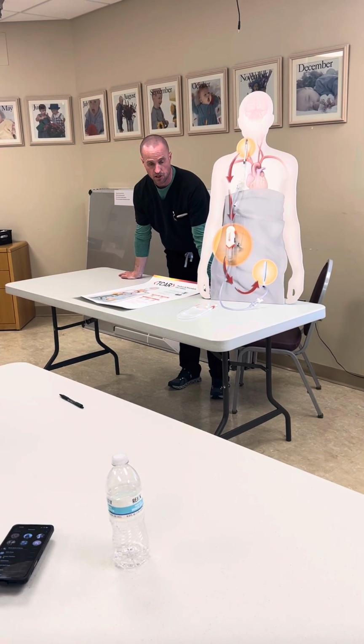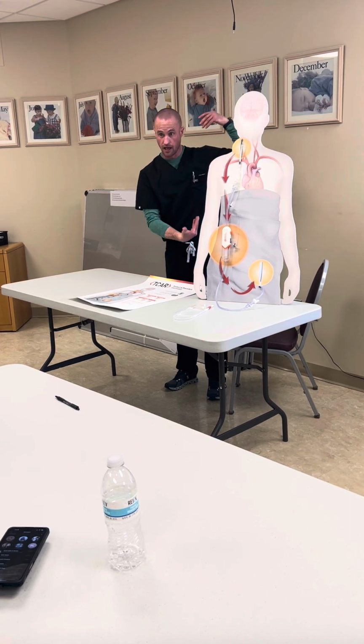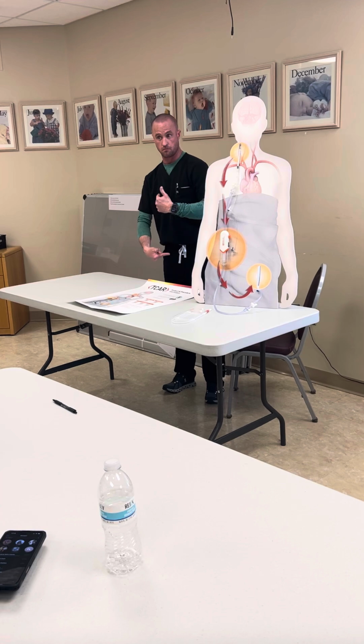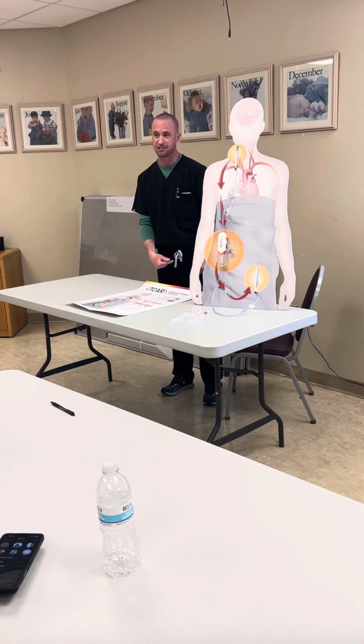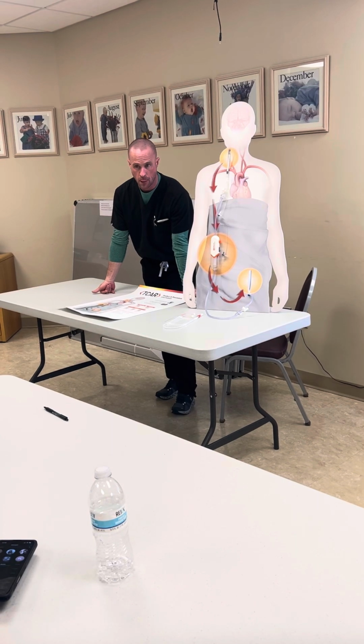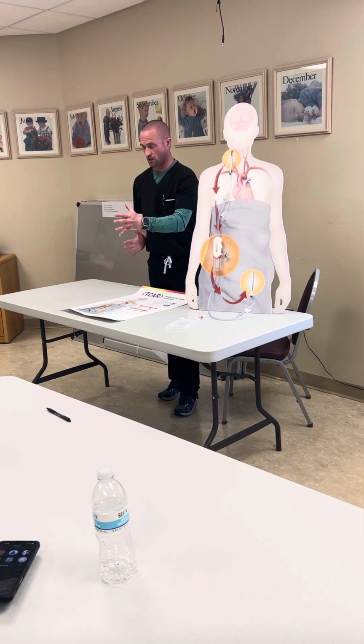And you said the tube needs to come in from the bottom, away from the head of the table, up on the head of the table. Okay. I had one scenario at Sonova where the bed was backwards and the C-arm was underneath, so I'm pretty careful about that. Like from the head, top of the head, or from the open side part of the bed, we're gonna come straight in.